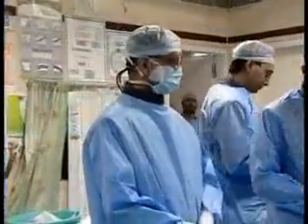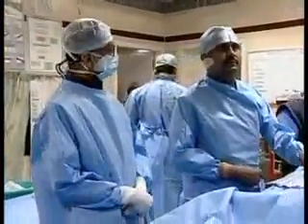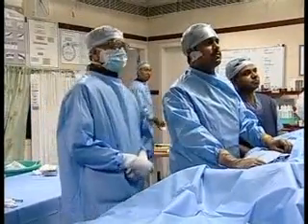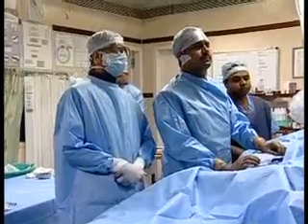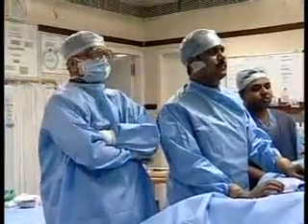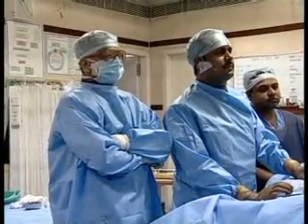Opening pressure was 190. Go ahead, Lawrence. So the opening pressure was 190 by 100. We have cannulated the left renal with a renal guiding.